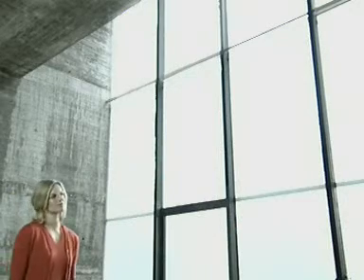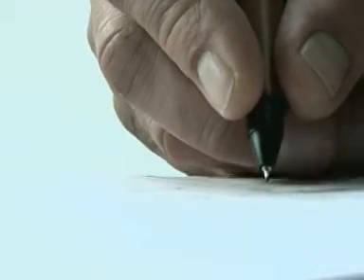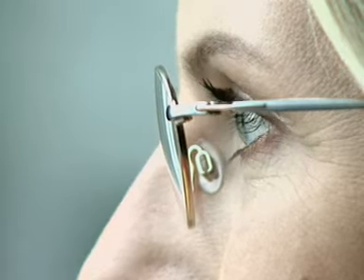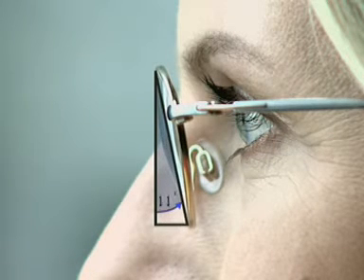Ask the patient to move around a little in order to relax their body posture again. Now mark the vision point in the lens with the eyes looking straight ahead in this natural body posture. This also marks the glazing height. Measure the distance between these 2 points and note the value in millimeters. Rodenstock will use this value to calculate the angle of pantoscopic tilt for you.